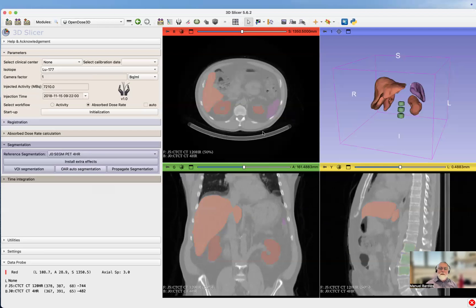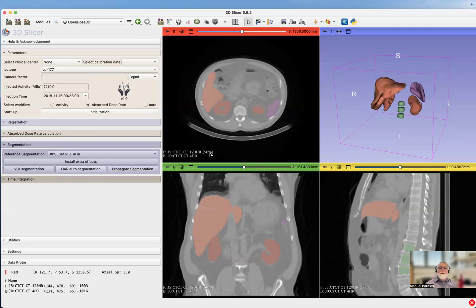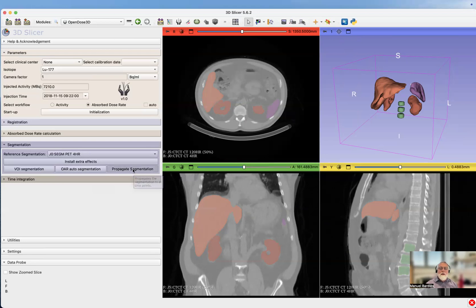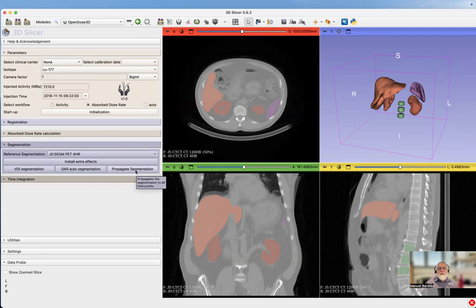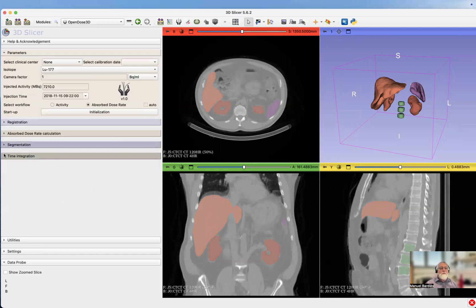But remember it's been done only on one time point at four hours. We have to propagate segmentation, and we do that, propagate at all the time points. Because the images are registered, we can propagate the segmentation using that transformation. Here we go.